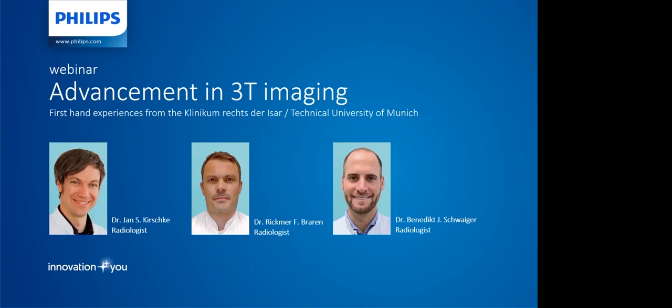Great. That actually leads me to the next question from one of our customers: do you also do 2D images in the brain with Compressed Sense? Yeah, definitely. As I showed in the most used imaging sequences during the 2 weeks of comparison, about half of these sequences were 2D sequences, in particular conventional 2D T2 TSE sequences. We still do.